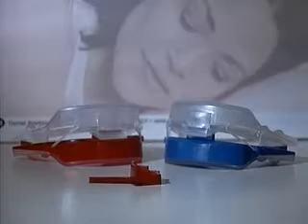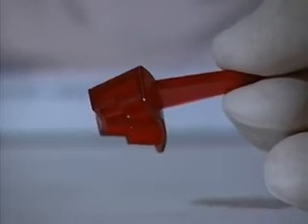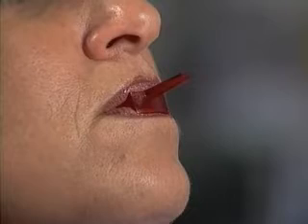The NORAD anti-snoring device is available in two openings: 5mm and 7mm. The enclosed bite guide will help you determine which size NORAD to use. Have the patient bite on the first step — 5mm opening — and then on the second step — 7mm opening — breathing normally each time. Have them advance the mandible to a near edge-to-edge position. The step that results in the best breathing indicates which appliance to use. If both sizes feel the same, start with the 5mm.